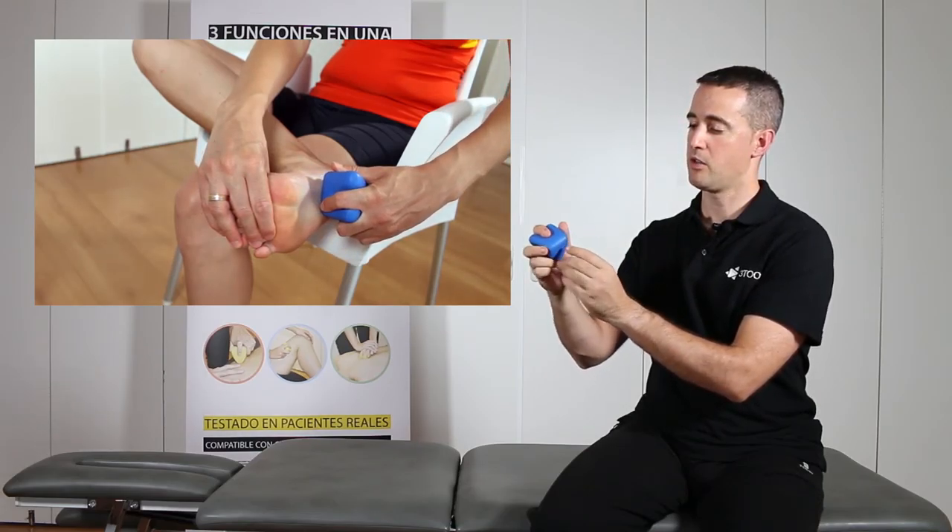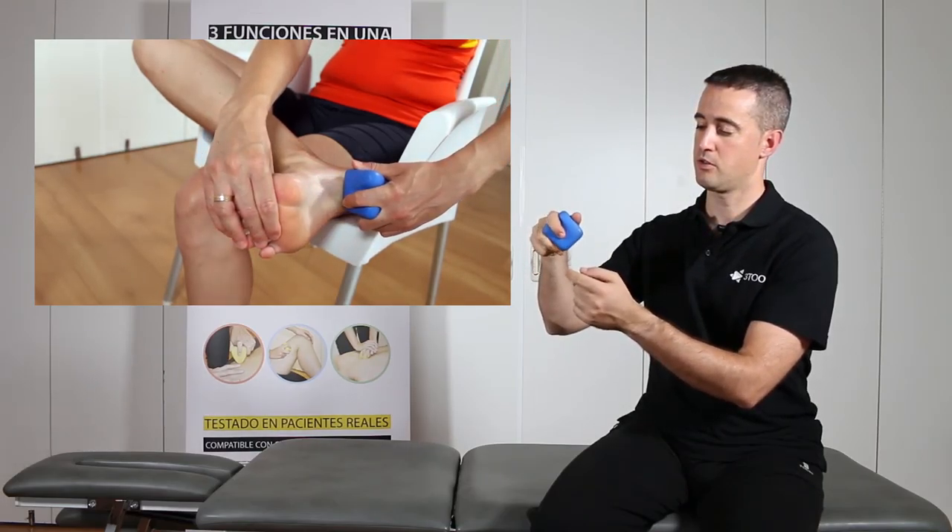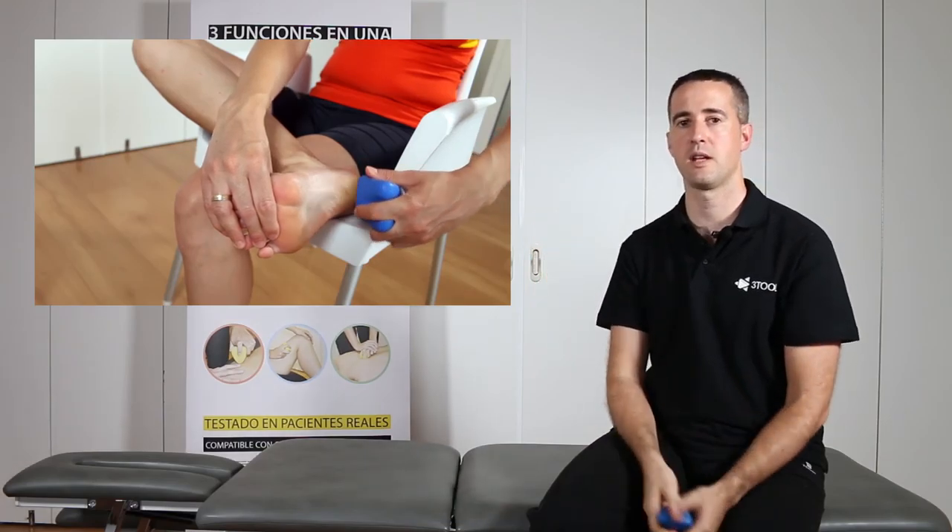Another option is to manually carry out light massage or massage exercises with the rounded zone of the tool.